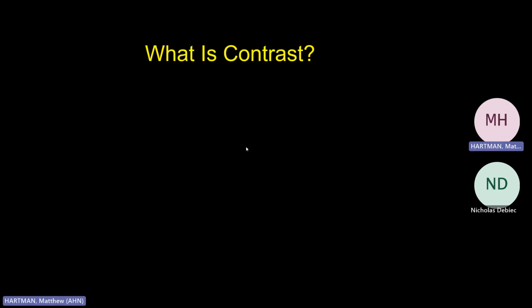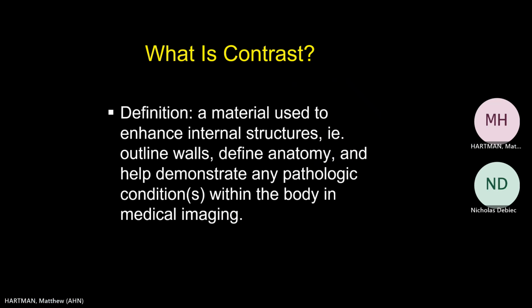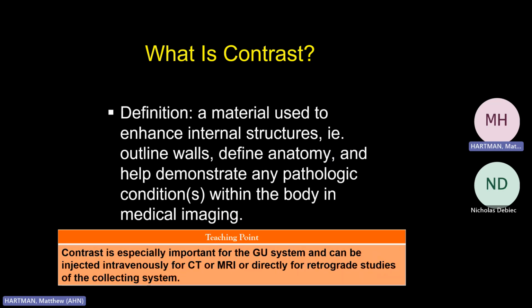To study the kidneys often helps to have contrast. We'll have a separate module on contrast, uses, indications, contraindications. But let's start off by defining it. Contrast is a material used to enhance an internal structure, outline walls, define anatomy, and especially important for GU imaging.